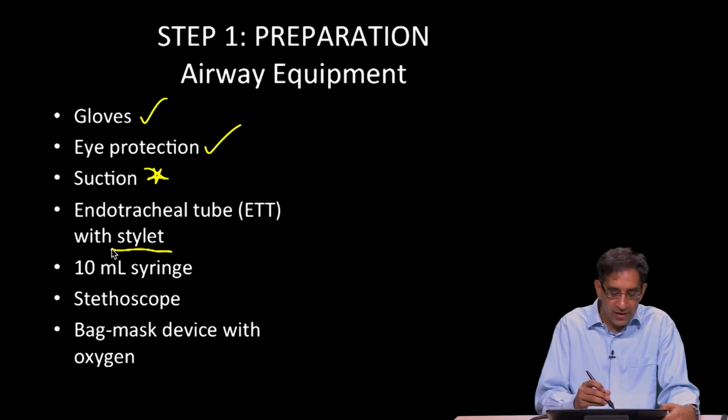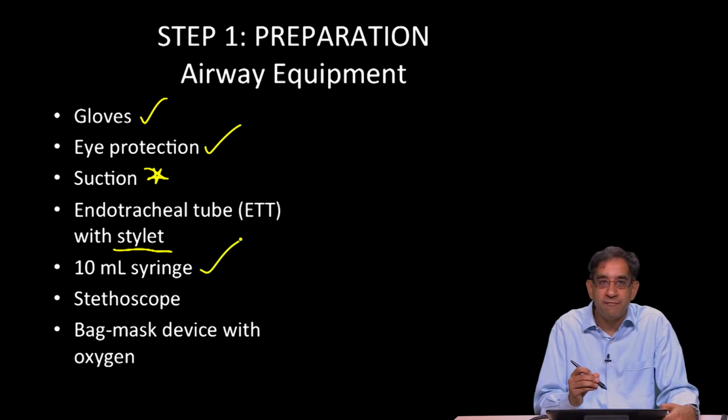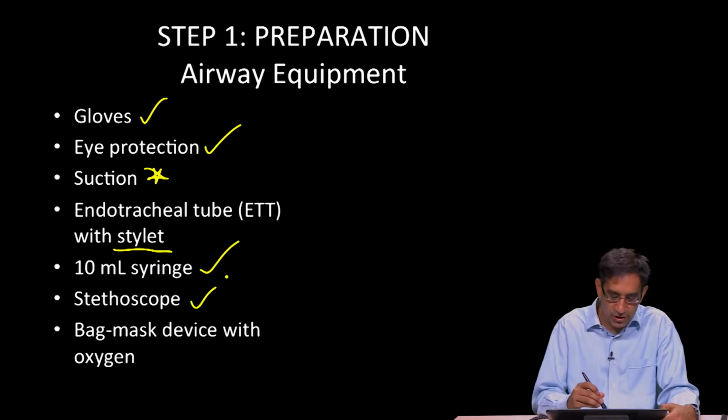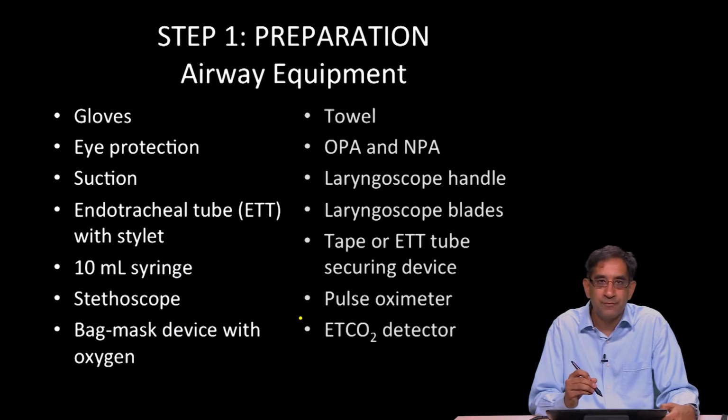You want to get your actual endotracheal tube ready, figure out what size you need, insert a stylet, and then have a 10 milliliter syringe so that you can blow up the cuff. You need a stethoscope so you can listen to breath sounds after you've completed your procedure, and then a bag mask device connected to oxygen so that you can ventilate the patient before the procedure, after you've inserted the endotracheal tube, and in the case that you're not able to insert the endotracheal tube, you might need to ventilate the patient. So having all these things together is important.